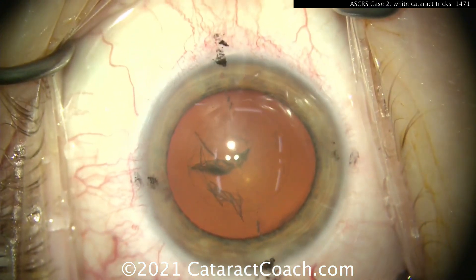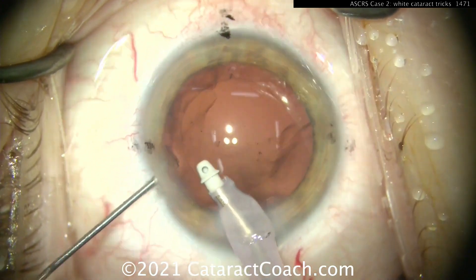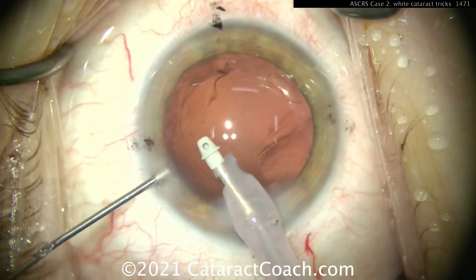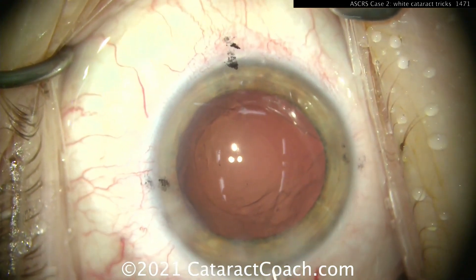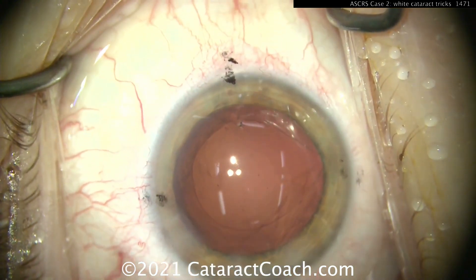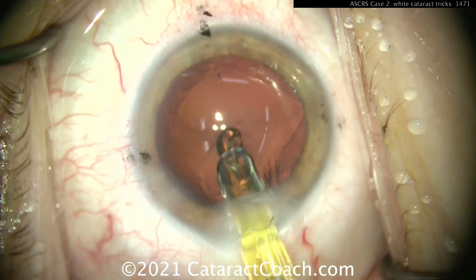Let me show you this case here too. Here's an interesting case: you do a routine cataract case and look at the end of the case — notice, look at the right side of the screen, that anterior capsule rim got broken. I'm not letting the AC collapse, and also don't overfill the eye with viscoelastic — don't overpressurize, because you may cause that rip to extend to the posterior capsule, which you don't want.